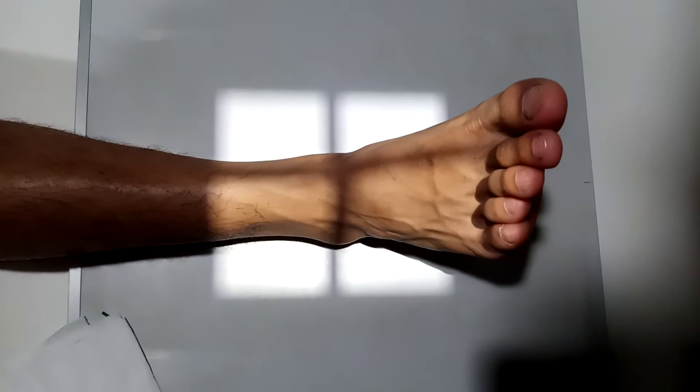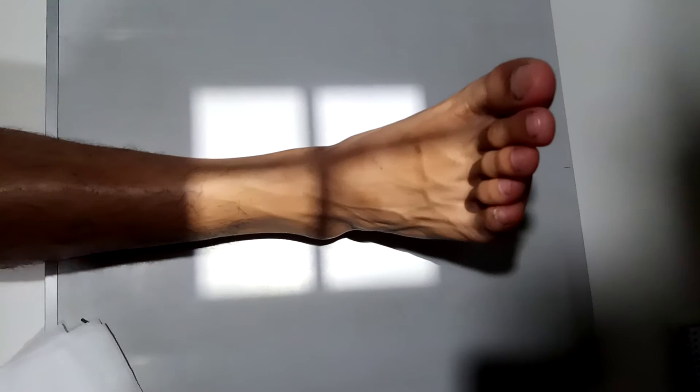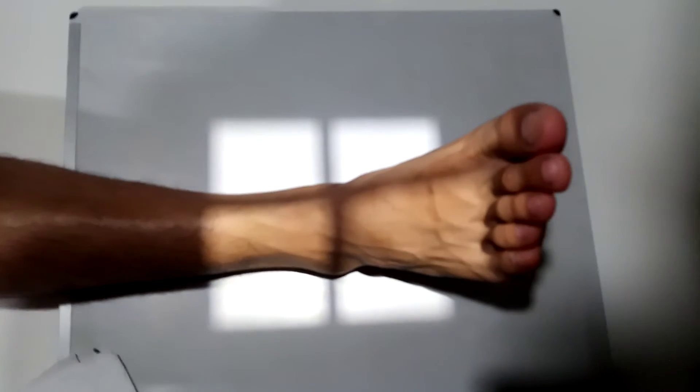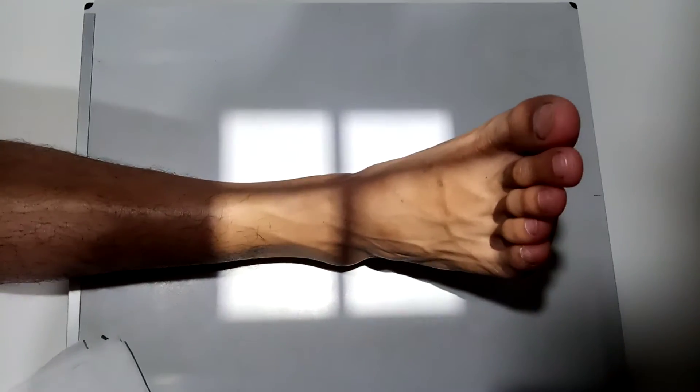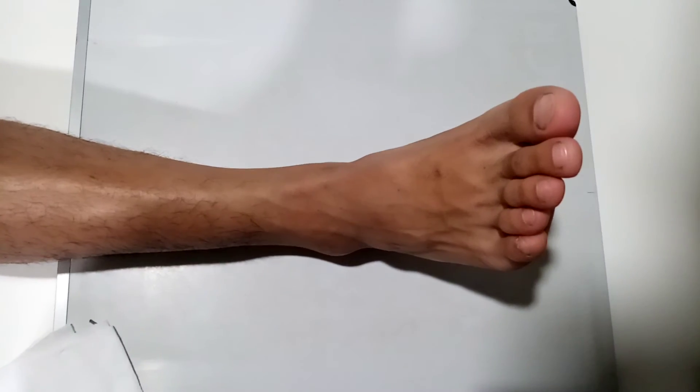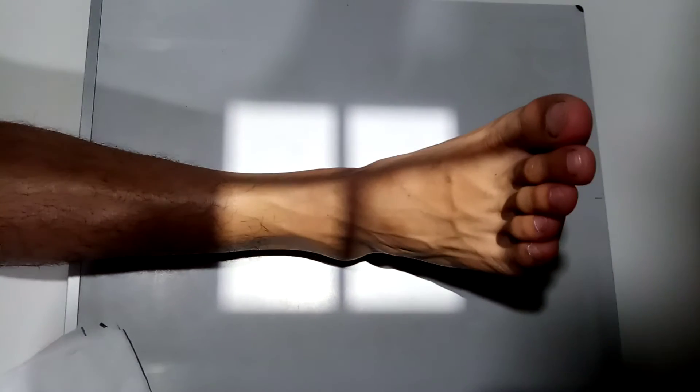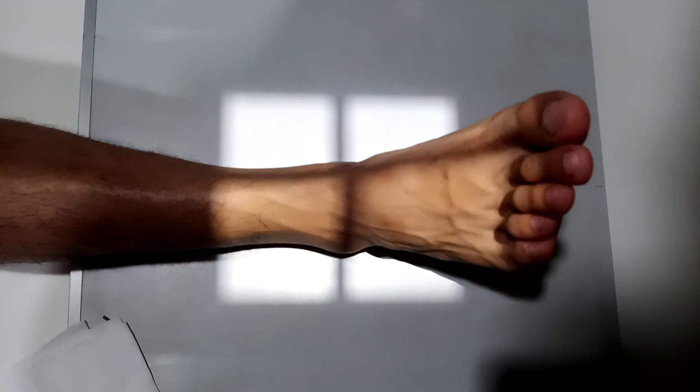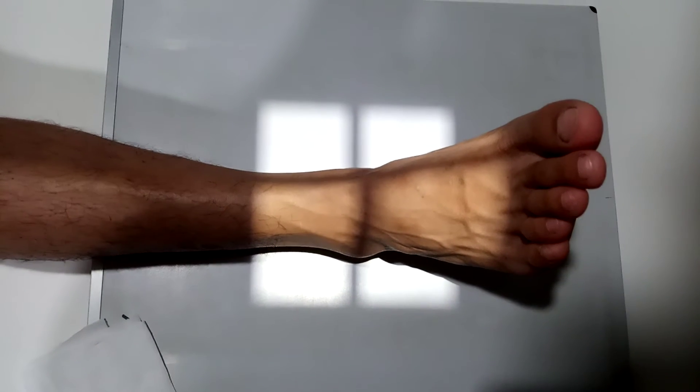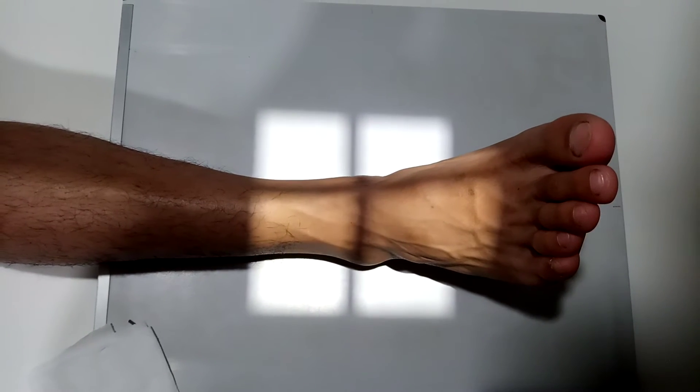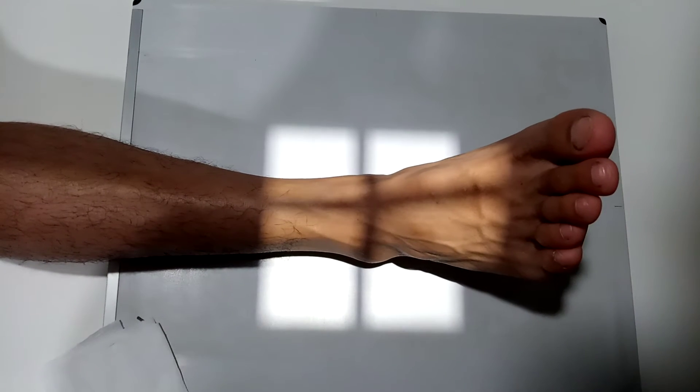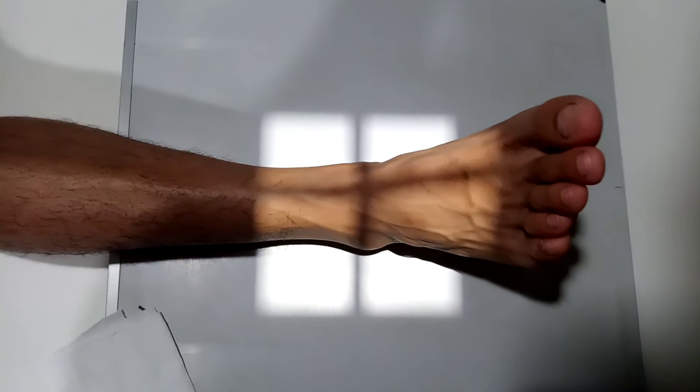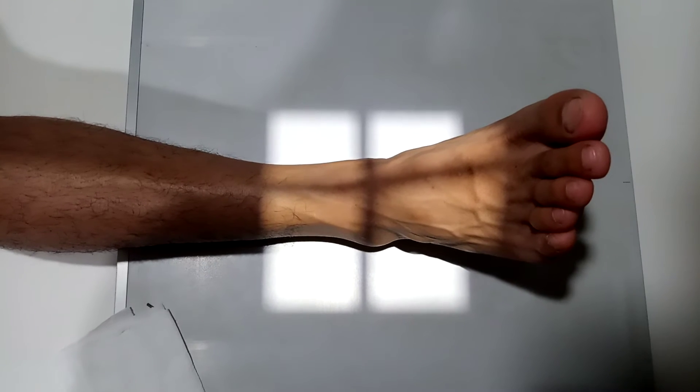Then, before exposing the ankle of our patient, make sure that you are going to shield his gonads because the gonads are very sensitive to radiation. Let me check for collimation and centering. Ensure that there will be no rotation. Perfect.